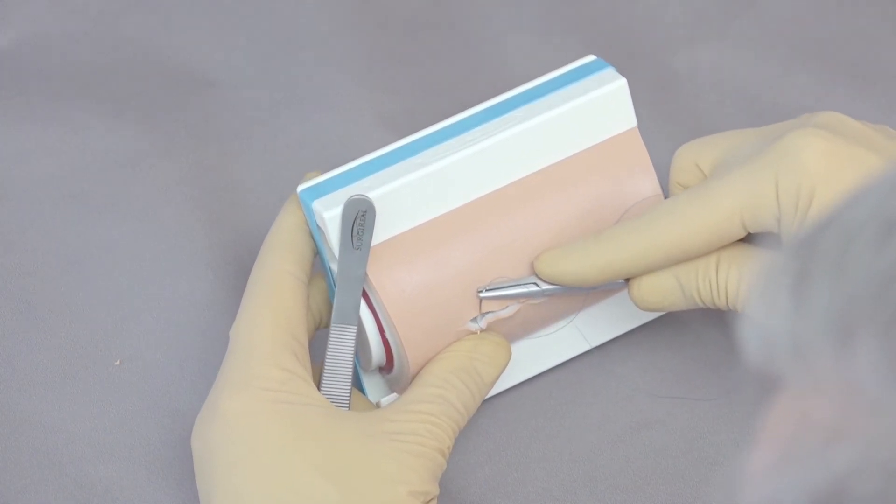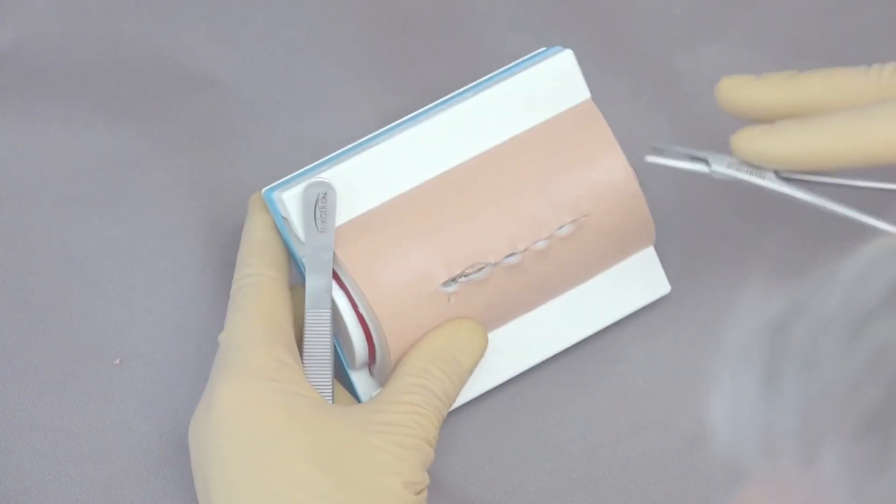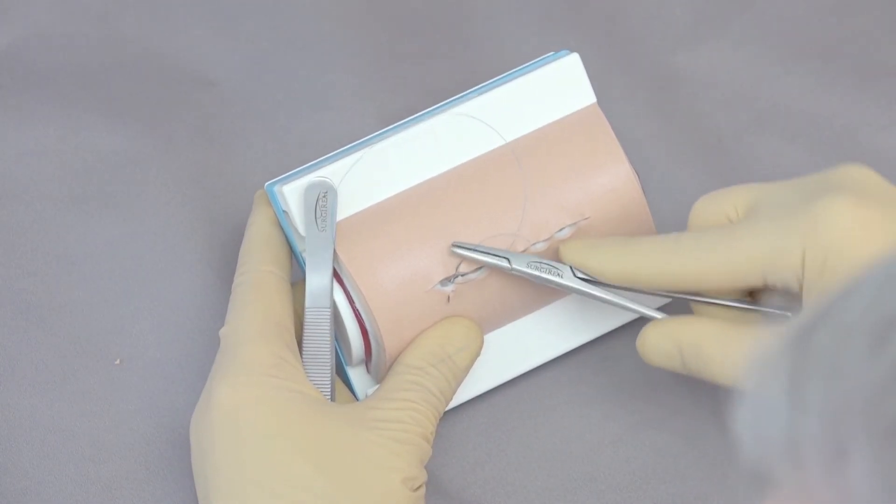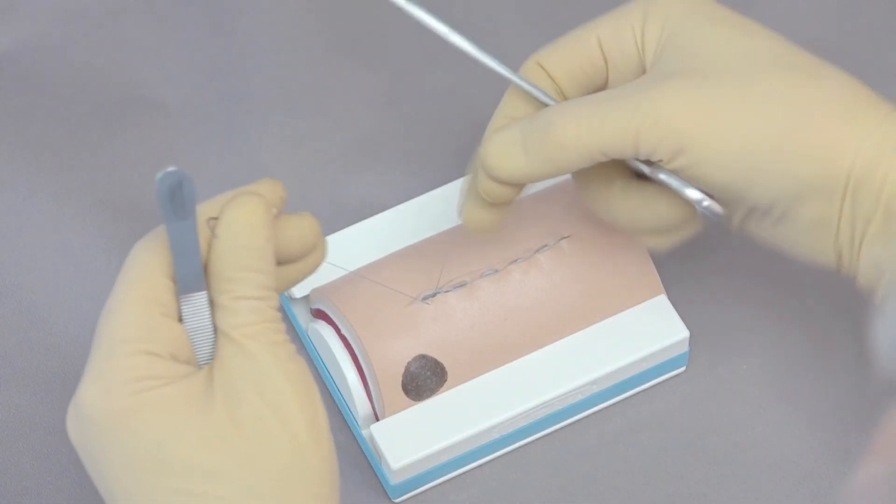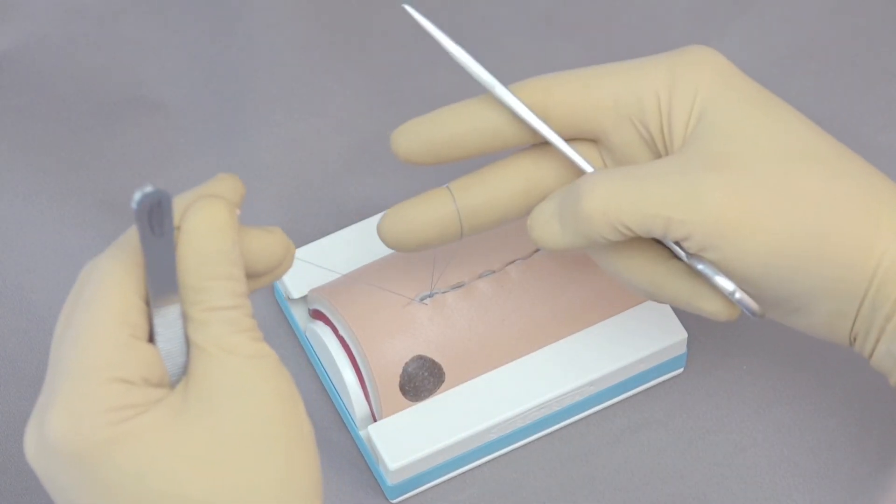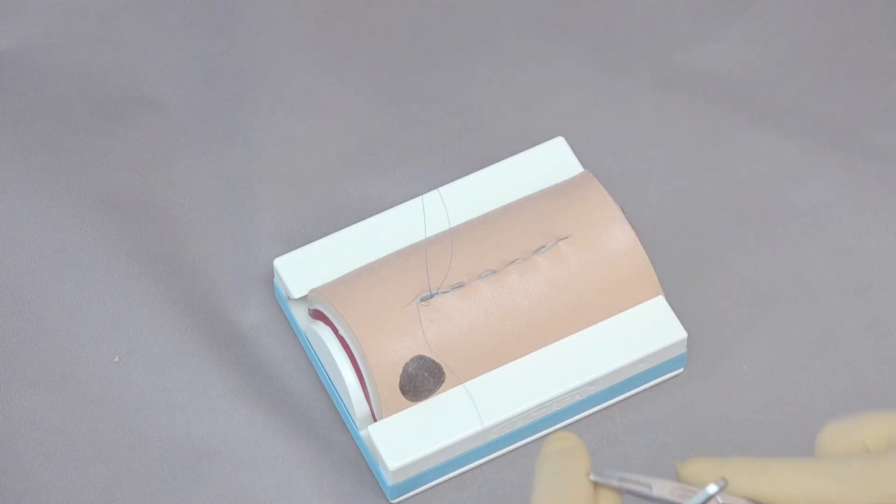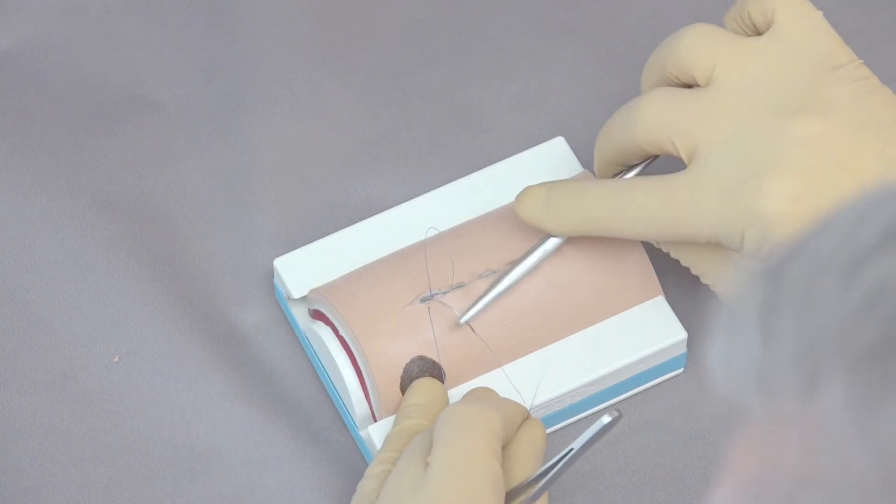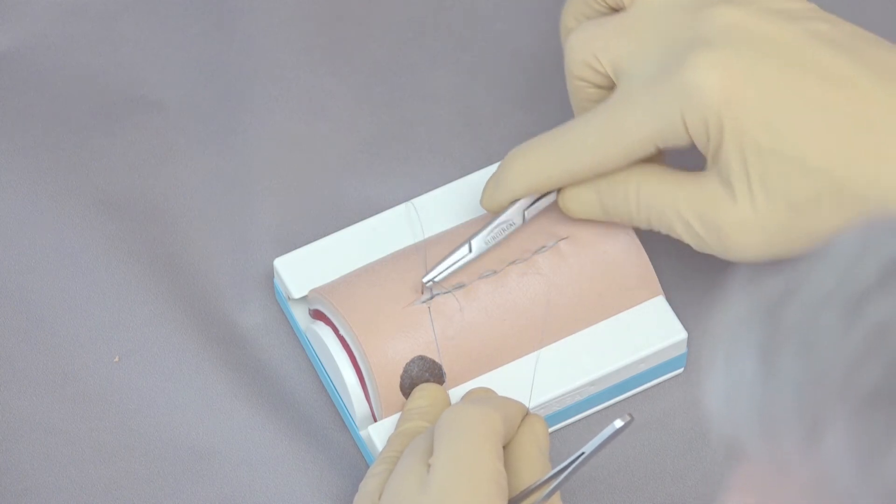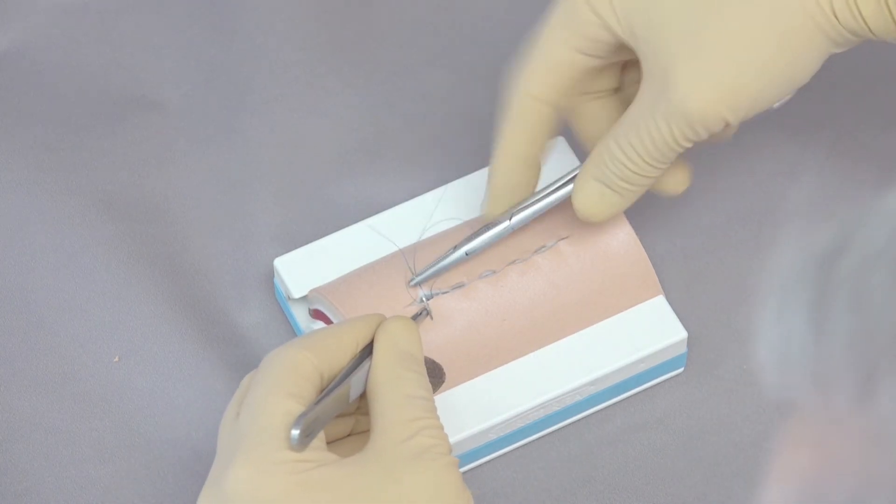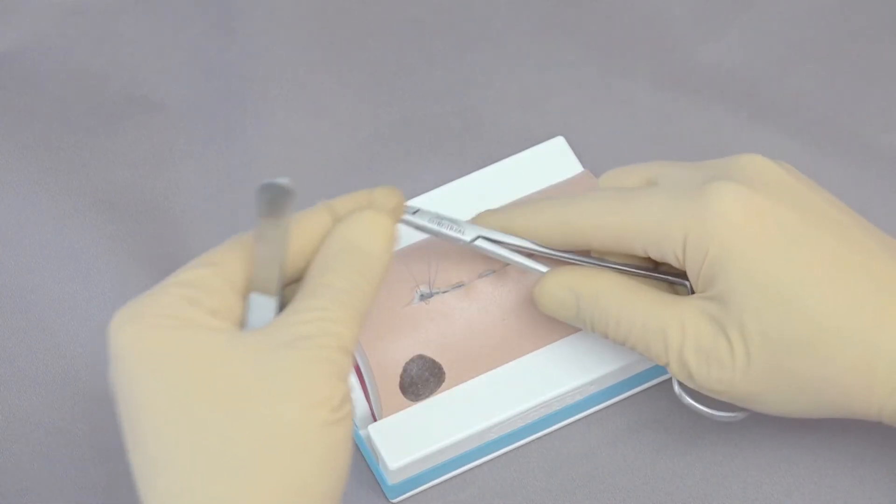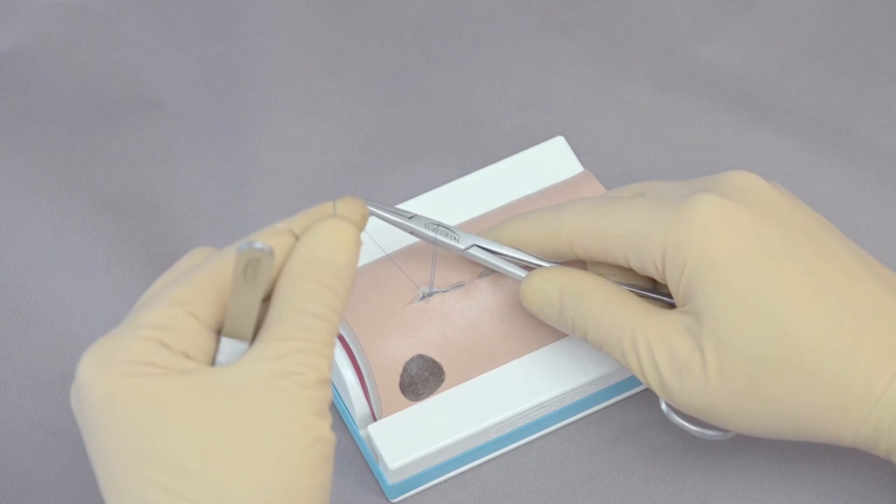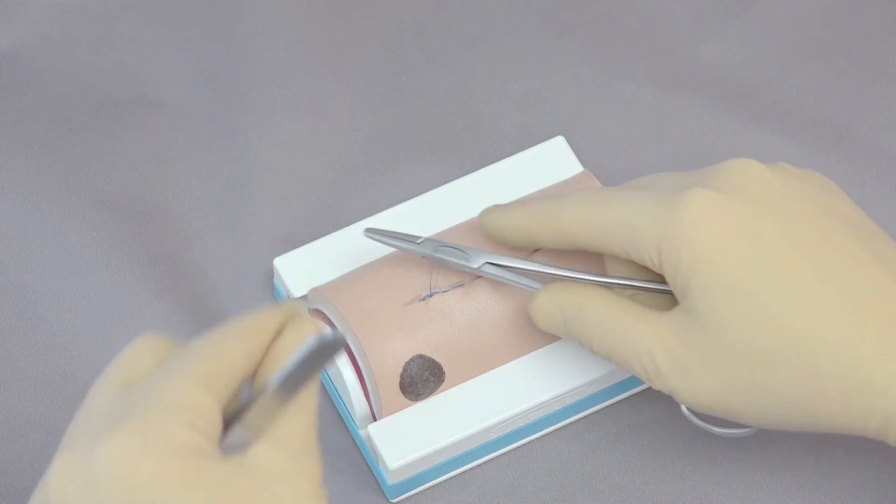Now we need to come from the bottom back to the superficial area again. Again working our way right to the junction of the dermis and epidermis. So now both of these are coming through the bottom, so we have to do that one more time with this end.